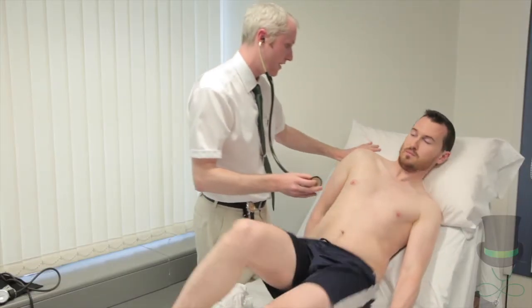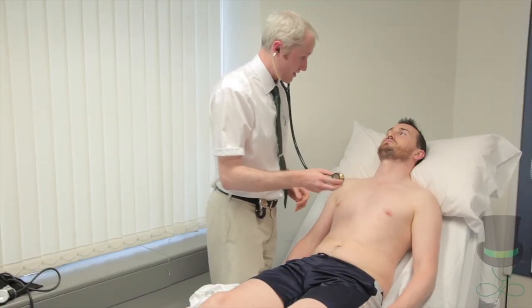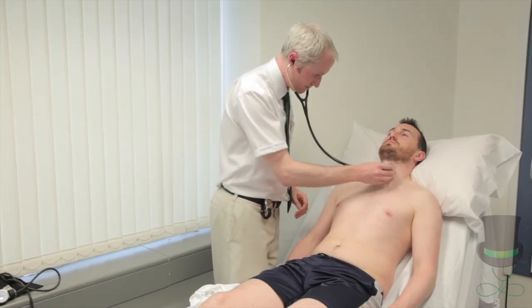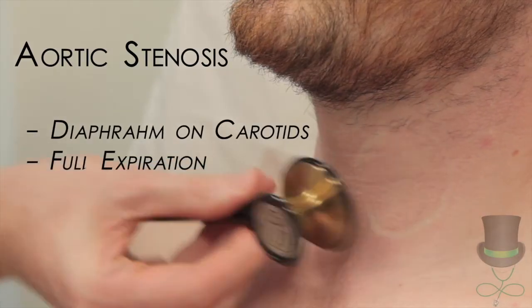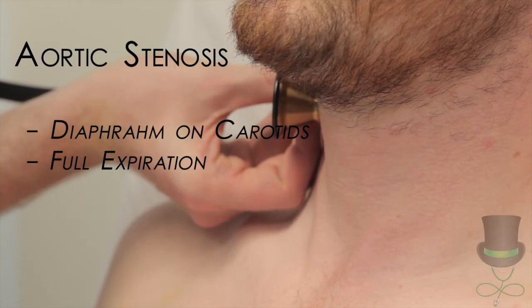Thank you, you can come back here again. I need to do the same thing again whenever you're ready. For aortic stenosis, place the diaphragm over the carotids in full expiration. Aortic stenosis will be heard loudly in both carotids, unlike carotid bruits.